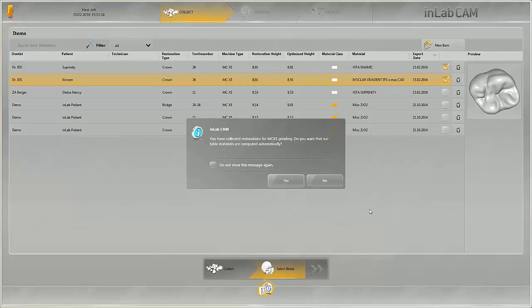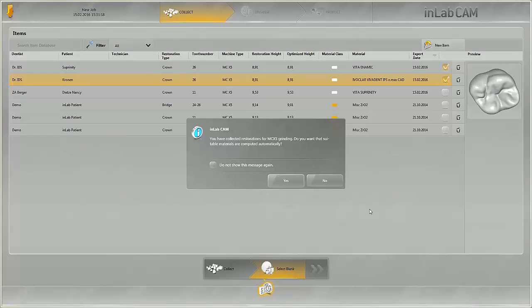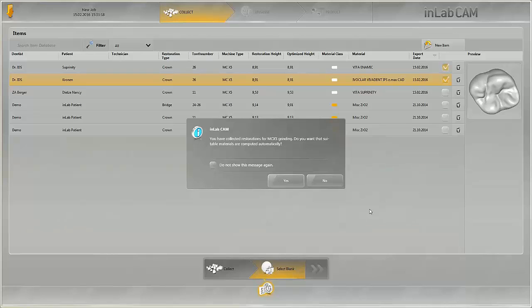This can save a lot of time, particularly with a larger number of restorations. The multi-block holder holds up to six blocks which, according to the planned restorations, are selected automatically by the software. Automatic selection of the workpieces is confirmed by pressing OK.